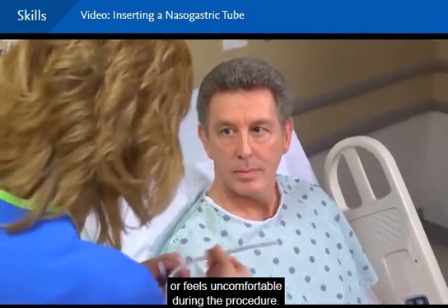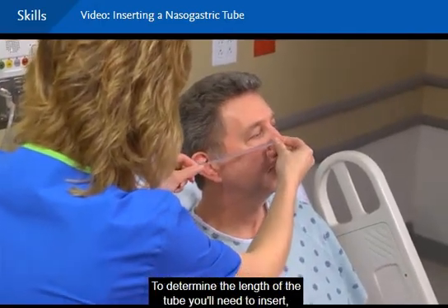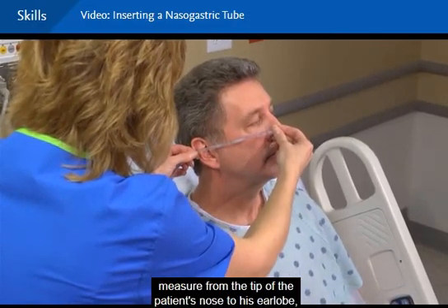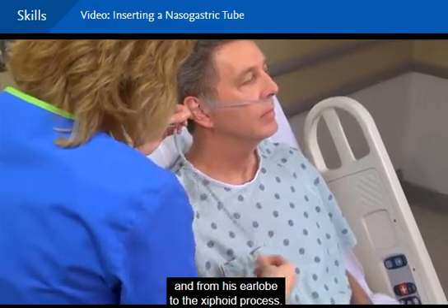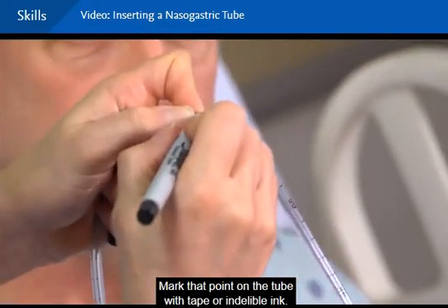All right, I'm going to measure the tube now. To determine the length of the tube you'll need to insert, measure from the tip of the patient's nose to his earlobe, and from his earlobe to the xiphoid process. Mark that point on the tube with tape or indelible ink.